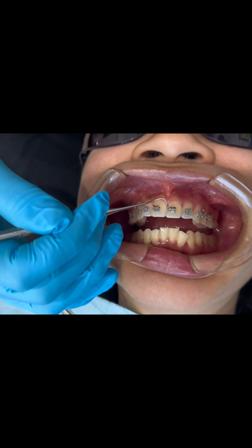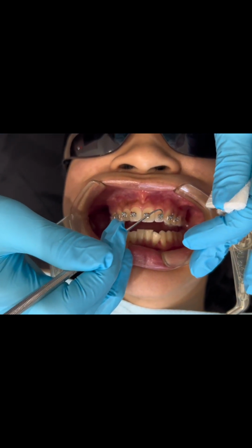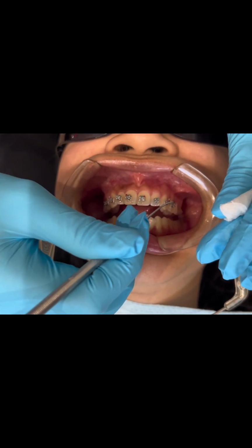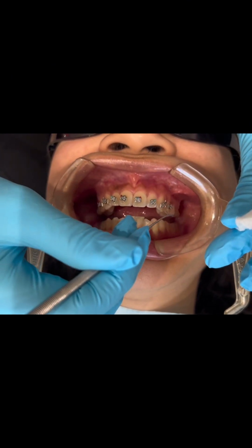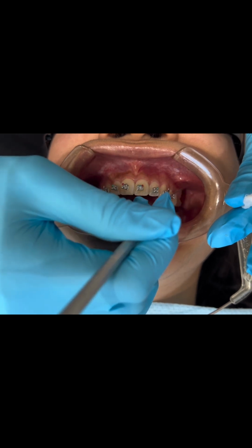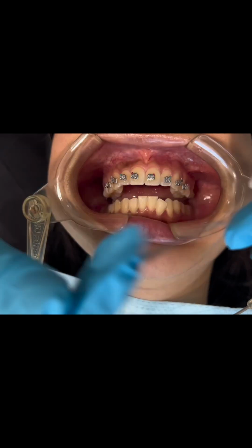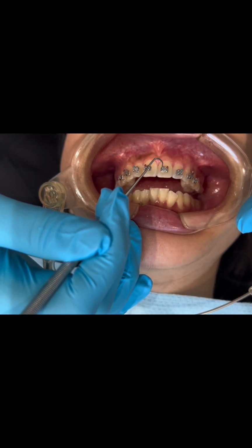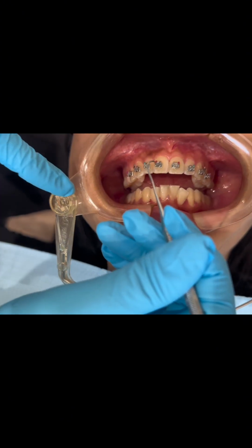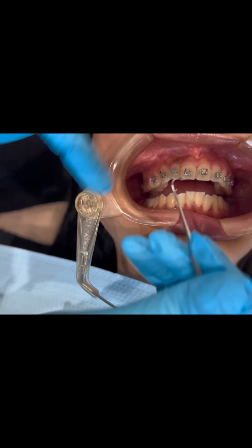All right, and I cover as I go. But just for the sake of this video, I'm just gonna move quickly here. As you become an experienced assistant, you're gonna get an idea of where the doctor puts the bracket, and you can even put it where you think he's gonna put it. For example, and I might be way off here, but I believe it's gonna go right there. See? And so I can put it there for him. Get it as close as possible to where you think he's gonna put it.